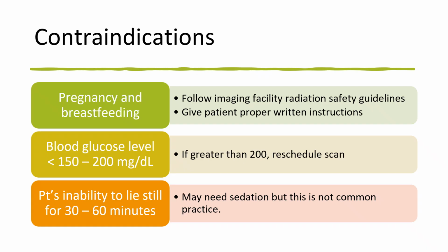Patients' inability to lie still for 30 to 60 minutes has to be taken into consideration. You can give sedation if needed. Of course, follow your department protocols and policies. You as the tech may not be able to in some places, but sedation is just going to allow the patient to relax a little bit.